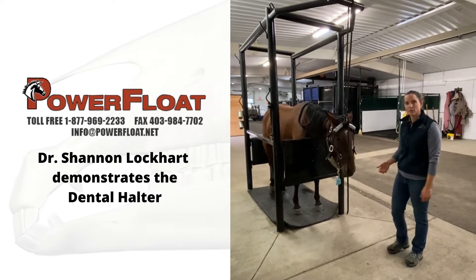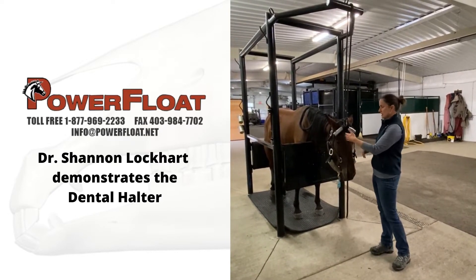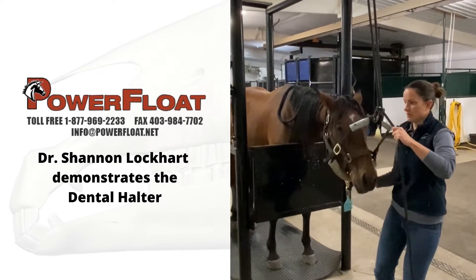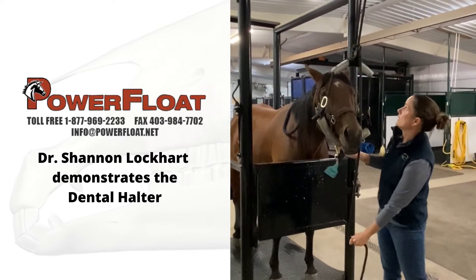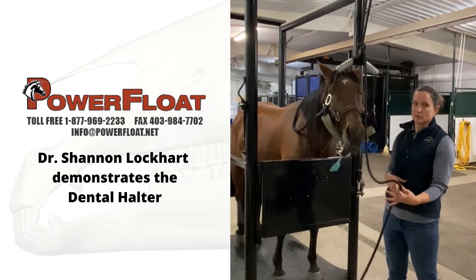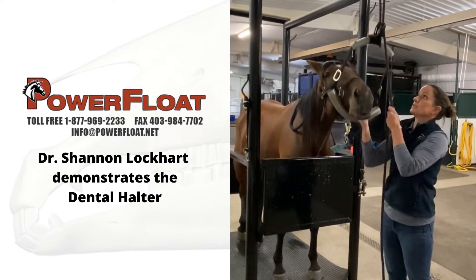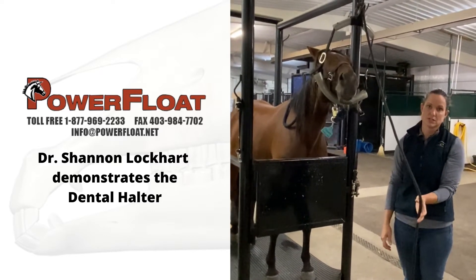There's another way that people like lifting the head. That other method is just grabbing the end of your rope going towards you, pull the head up, and then pull down on the rope — and it just kind of automatically locks a little bit for you too. So: lift the head, pull down on the rope, lock the head.